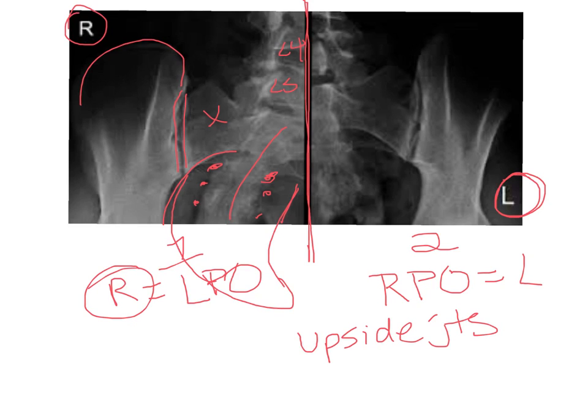And that should do it, folks. If we have any questions, let's talk about them in class. These are great projections to start really understanding distortion. Remember, when you are angling a patient or angling the body part, you are causing foreshortening of an area. If you are angling the tube, you are causing elongation of a structure. And those are types of shape distortion.